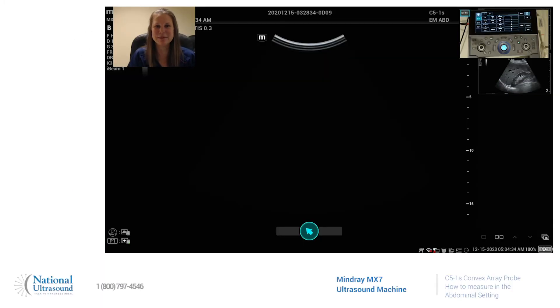Hi, my name is Jackie Klebeck. I've been a registered cardiac, vascular, and general sonographer for eight years. I'm here today at National Ultrasound on a MindWrite MX7 using the C5-1S Curvilinear Probe, and today I'm going to show you how to measure while in the abdominal setting.